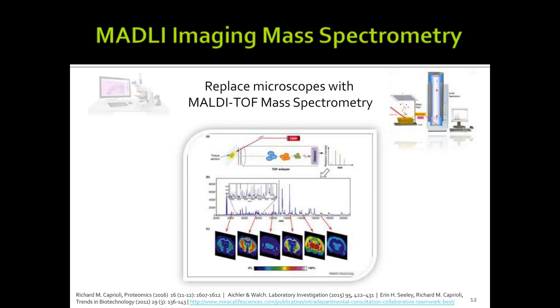With a tissue at the front, we can sample at different spots on each tissue, and we can also slice the tissue slides in different ways. As a result, we could get hundreds or thousands of spectra, as shown underneath here. All right, let me get my pointer here so that we know what we're talking about. This is one of the representative spectra from MALDI.